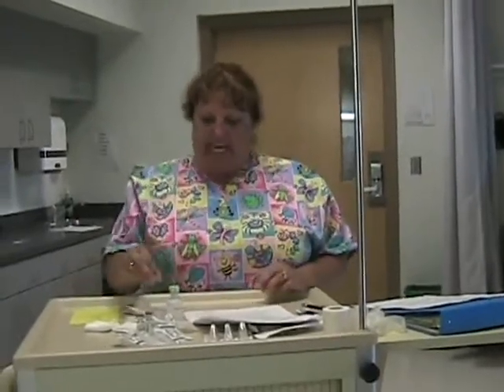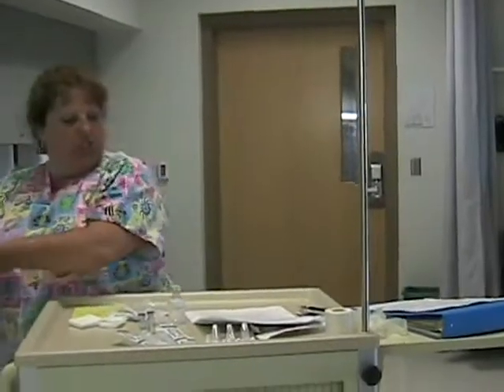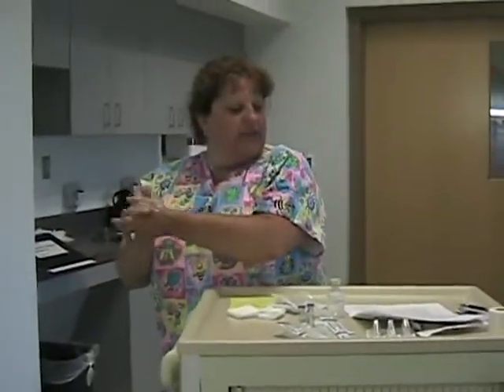So I would gather my medication, my syringe and needle that I will draw up from the vial, plus the needle I will go ahead and give the medication with to my patient, my alcohol, my 2x2 gauze, and have a pen readily available to go ahead and document on the MAR. Then I would go ahead and wash my hands to perform hand hygiene, come back, and I'm ready to begin the procedure. We're going to go ahead and pop the top off of my vial, as so.